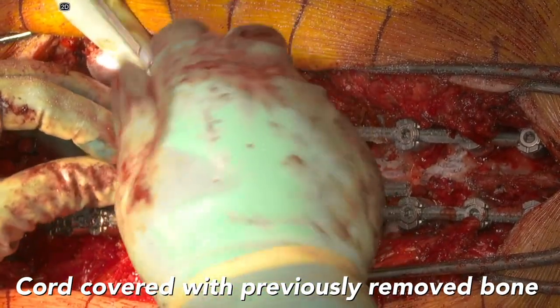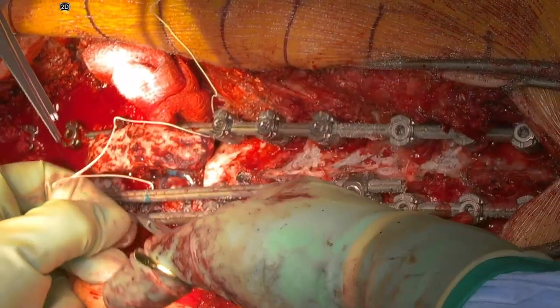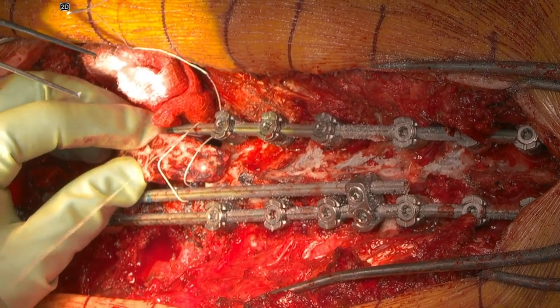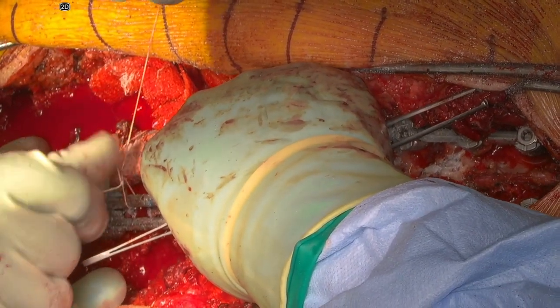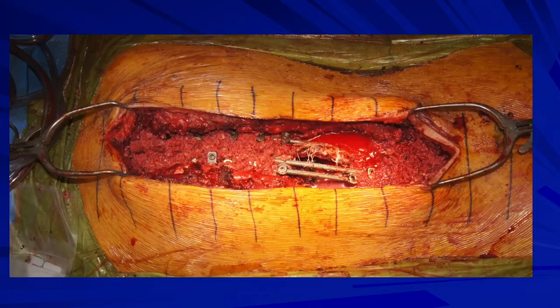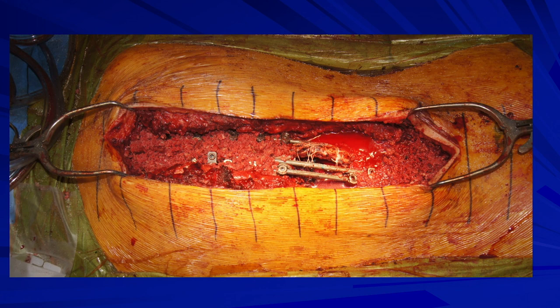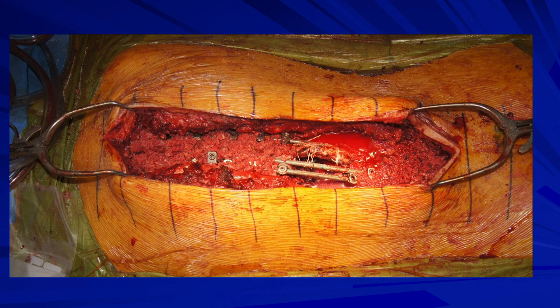The dorsal lamina that was resected from the fusion over the kyphosis is fashioned, shortened, and placed over the exposed dura and tied down with suture to hold it in position. Grooves are made into the lamina to prevent the sutures from slipping. This provides protection of the exposed spinal cord from mechanical compression as well as hematoma formation. The final construct includes multiple rods and the dorsal lamina protecting the open spinal cord area, providing an area of fusion with bone and BMP placed proximally and distally. The anterior bone graft placed adjacent to the cage on the sides is not shown.